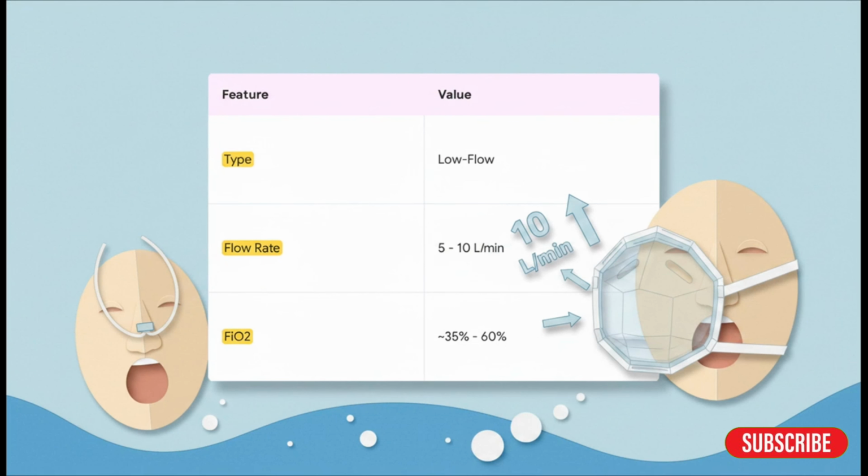So what if the cannula isn't enough? Well, the next step up the ladder is the simple face mask. You'll grab this one if a patient needs a bit more than the cannula can give, or maybe if they're a big-time mouth breather. Since it covers both the nose and mouth, we can crank the flow rate up to about 10 liters per minute and get a higher FiO2.